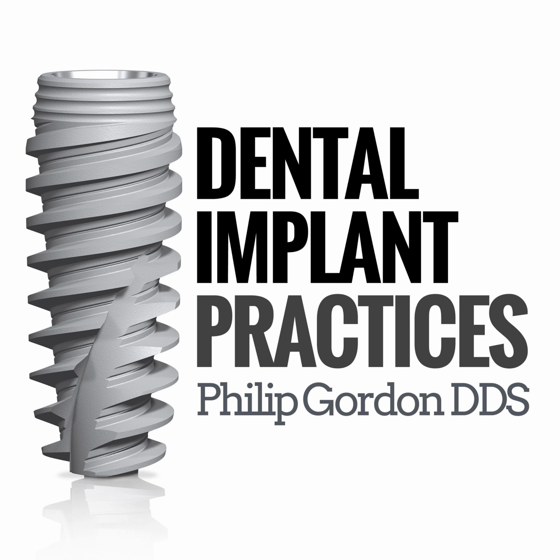With guided implant surgery, we basically put the guide in, we take our osteotomy drills, and boom, boom, boom, we're done drilling. The implant goes in, and we're done. And it's the exact implant that we plan to use because we used 3D planning to know exactly which fixture we're going to need. And so it not only cuts down on the time it takes to place the implant, I'd say it's probably about a 50% reduction in time.